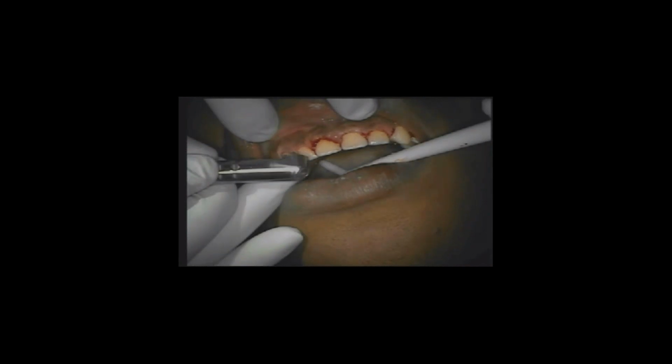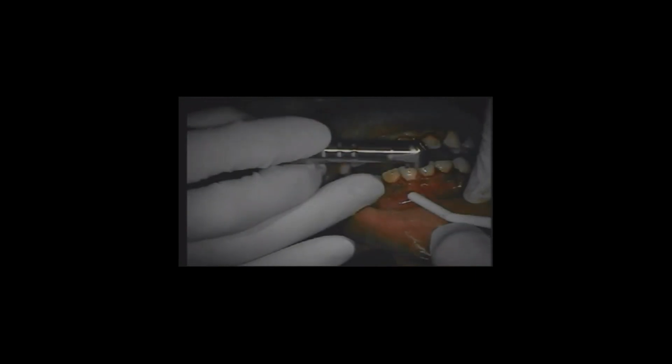And again, this is where you can see, in just those last few seconds, what the tipless handpiece allows us to do so efficiently: thin the papillae in the anterior-posterior dimension, and thin and start festooning the tissue interproximally, which there's no way you can do efficiently with an Nd:YAG or a diode. The fiber tip just doesn't allow that to happen. It didn't take me long to fall in love with the tipless handpiece on the Lightwalker, that's for sure.